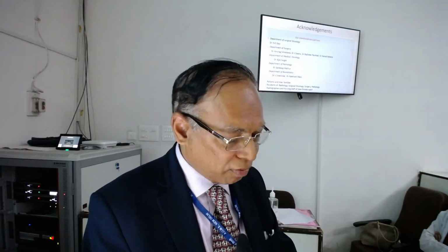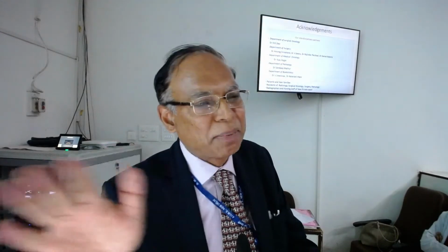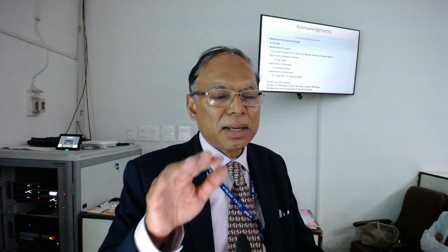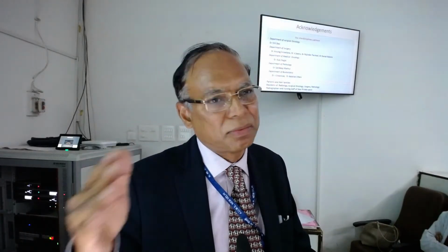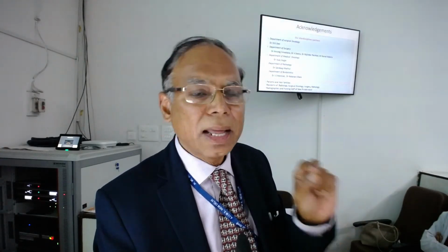For large lesions and for following neoadjuvant chemotherapy, although clips and other modern technologies, radio guided tools, etc. are there, one down to earth basic technique that some of our young colleagues like Dr. Piyush and Dr. Kamal developed was putting a 1 centimeter piece of the Ryles tube. After you assess the patient in MDT, and after 2 courses, when the response to chemotherapy becomes most prominent visible, if the patient is going to regress, it will regress at about the end of the 3rd week of the 2nd course. At that time, under local anesthesia, just put one small half a centimeter piece of the tip of the Ryles tube. Now they are putting a silicone catheter, urine catheter, and that remains palpable even at the end of complete remission. The clip becomes impalpable, whereas that tip of the Ryles tube is easily palpable. So we can use some basic technology, not just go in high end.